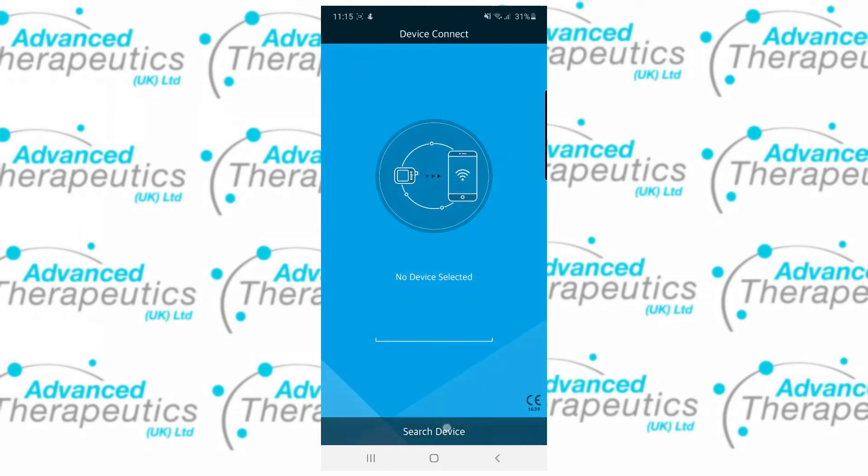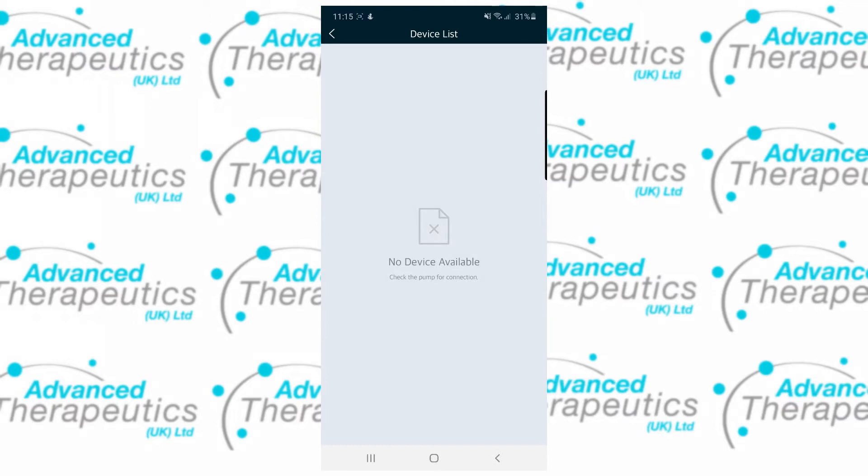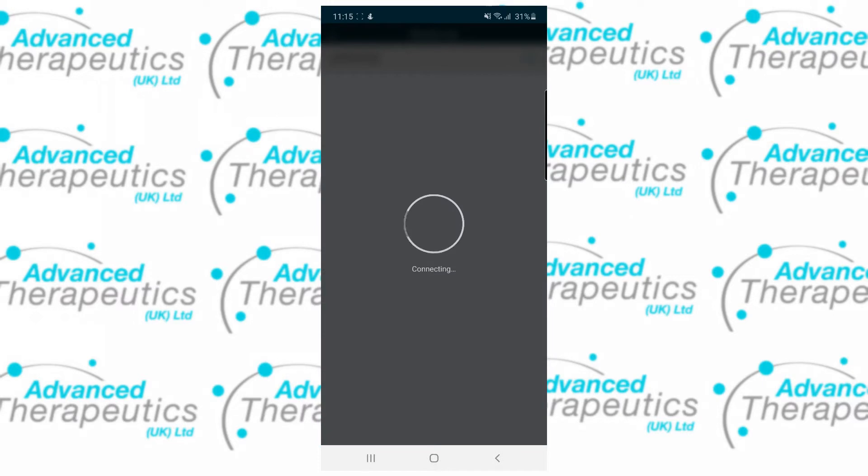Now the app should allow you to search for a device. Tap on search and wait for your serial number to pop up in the menu. This can take a couple of minutes the first time connecting. Once your serial number has appeared, tap on it and the phone will start to connect.